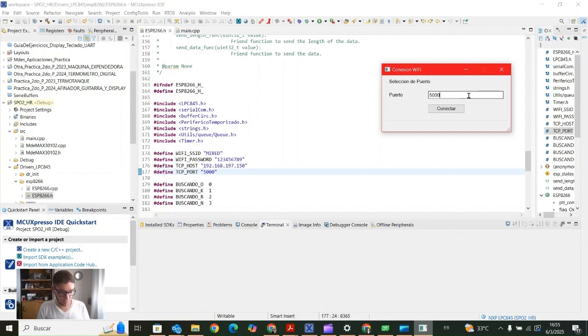Now I'm going to connect the battery. I'm going to show you, and here it is connected. Okay, this is how it should look. The Wi-Fi module should be with red light. That means that it's turned on. Also, I have the wire to the computer. For the presentation, I'm going to only have the box opened.